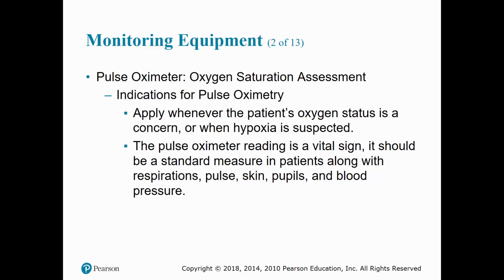Oh yeah. If the patient is receiving supplemental oxygen and the pulse ox reading is near or slightly greater than 94, it may still be an indication that the patient is hypoxic. If the supplemental oxygen is removed, the reading may decrease to less than 94% again.